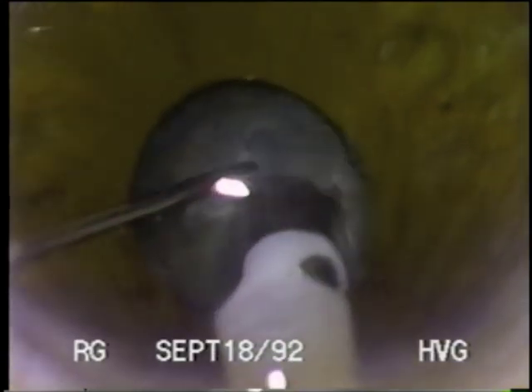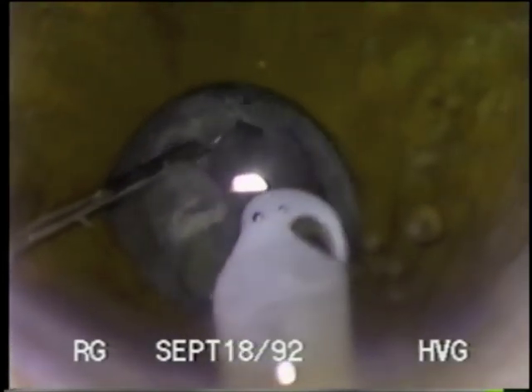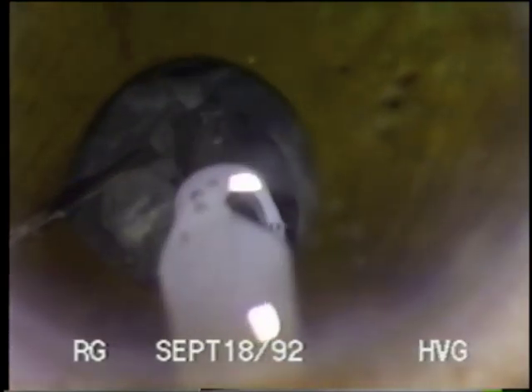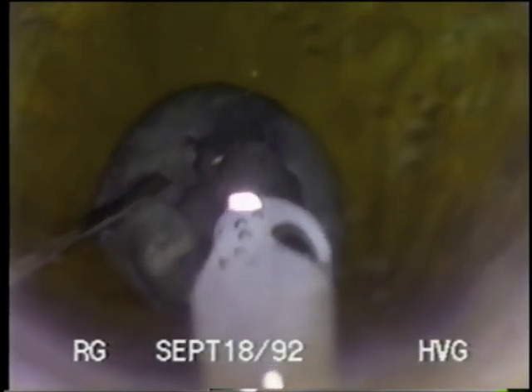I originally developed the downslope sculpting technique in small pupil cases due to the limitation of view and the desirability of keeping the phaco tip near the center of the lens. Because small pupils may have smaller capsule openings, care must be taken when utilizing downslope sculpting to prevent damage to the upper portion of the capsule or the upper zonular ligaments. Slowing down here will help to indicate what the spatula and phaco tip are doing during downslope sculpting. The spatula is used to stabilize and nudge the nucleus inferiorly, either by placing the tip in a notch in the inferior section of the trench or by placing the tip on top of the nucleus itself.